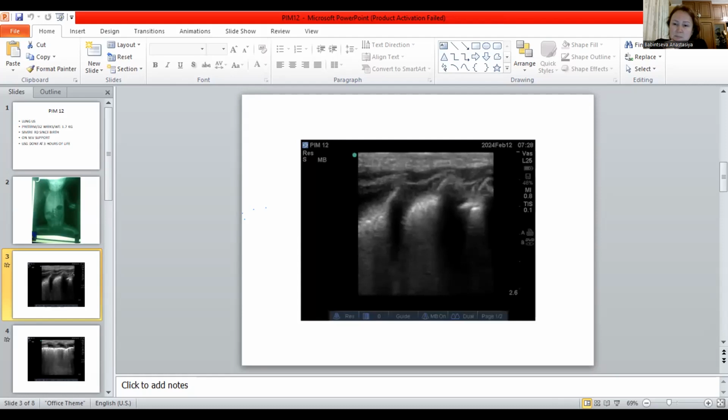I know some of my colleagues across the North Atlantic and in Canada do. My only comment is to be aware of the heart-lung interaction, especially early on in the first few days of life. If you increase PEEP that much, you might decrease venous return, and then you'll make saturations much worse because the heart is not getting enough blood to perfuse the lungs. So for me, gentle and slow in the early stages has always been a better approach. We've got a whole session on what the open lung strategy is, and the patterns you see. There's a pattern described with atelectatic lung for recruitment, just called an S pattern.